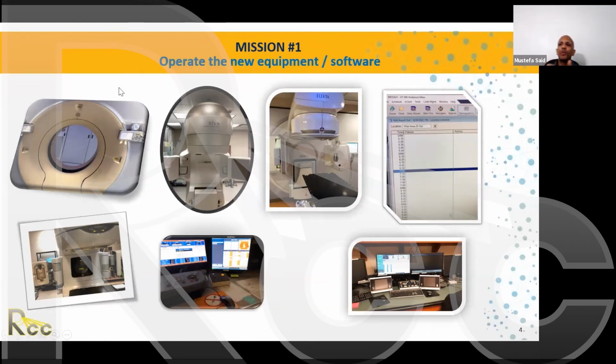So when you do simulation, if you do a mini scan to locate the tumor, drop the mAs by half. You don't need it. You will be able to see the tumor. And the doctor has to be there anyway. The doctor already knows that the mass is seen on a different CT scan, PET scan or MRI. The doctor is going to come and identify the tumor for you, but you can still see it.